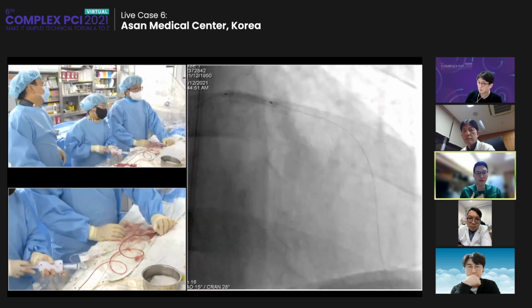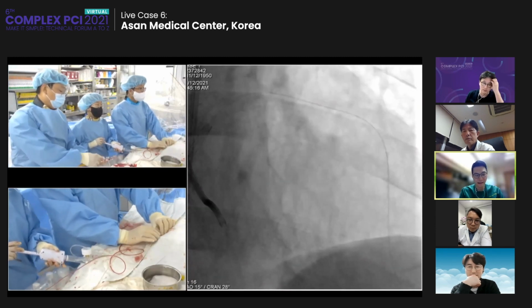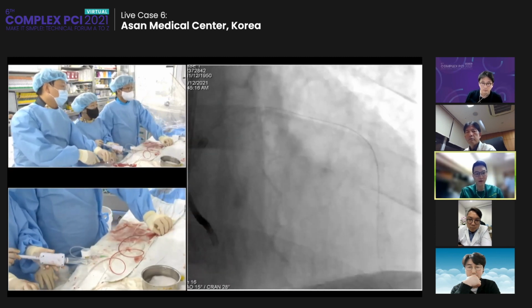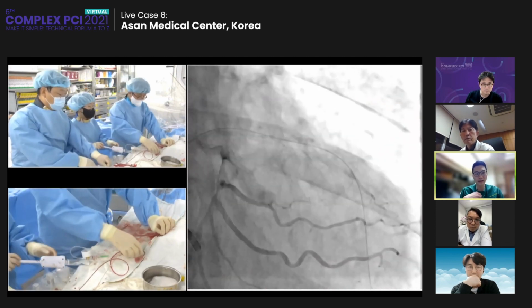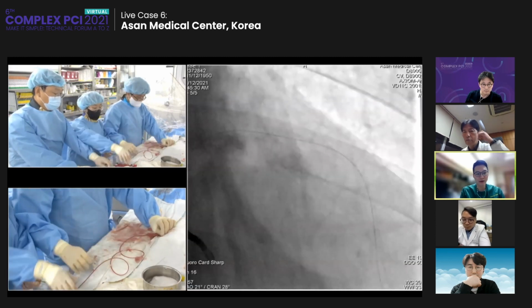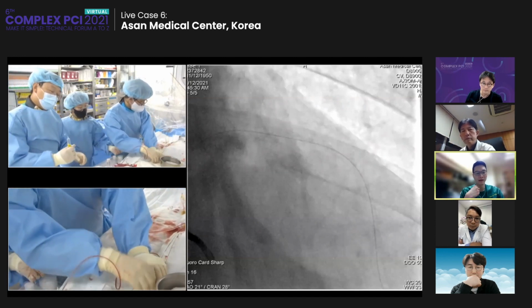We also use IVUS a lot during the procedure, like IVUS-guided proximal puncture of the CTO, and if that fails, we may use IVUS-guided rewiring inside the CTO body. Even for retrograde, in case the retrograde wire goes somewhere else, we can use IVUS to check where exactly the retrograde guide wire is, and then work further from there on strategy.